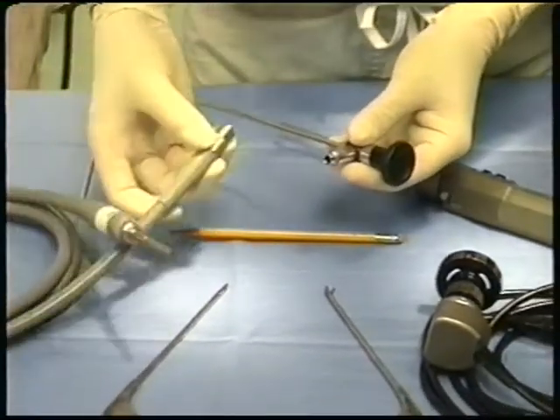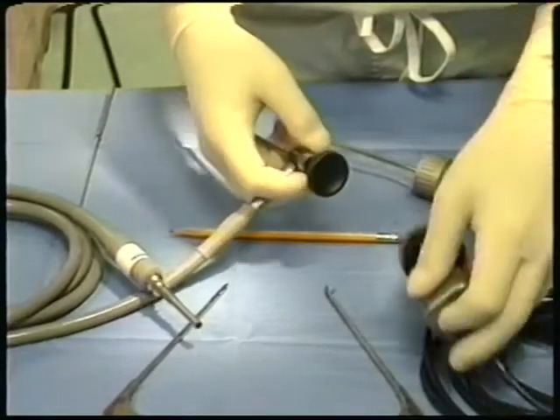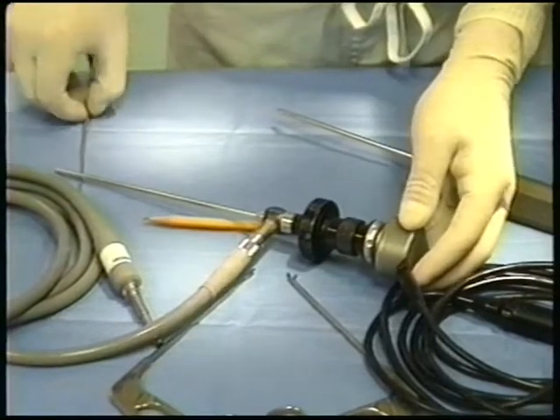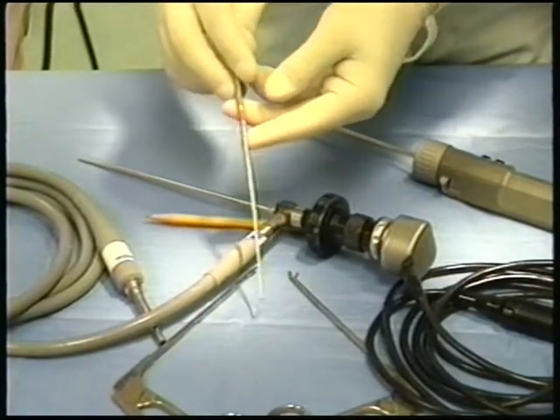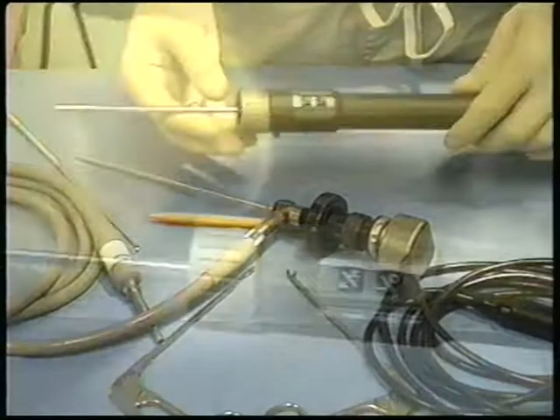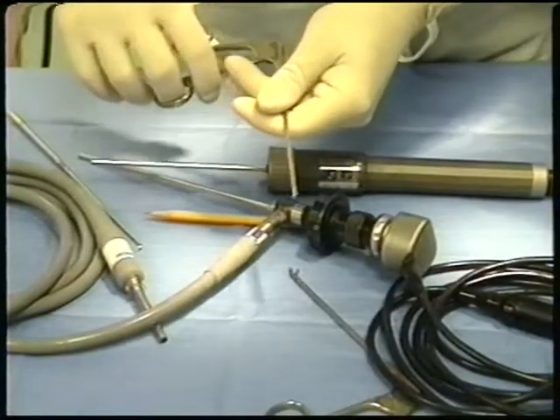The arthroscope is connected to a light source for illumination of the interior of the joint. A camera is connected to the arthroscope, which allows viewing the procedure on a video monitor. At the same time, a tape is made to document the problem and its correction. Other instruments include the probe for examining tissue to see if they are damaged, the shaver, which trims tissue, and the scissors for cutting tissue.